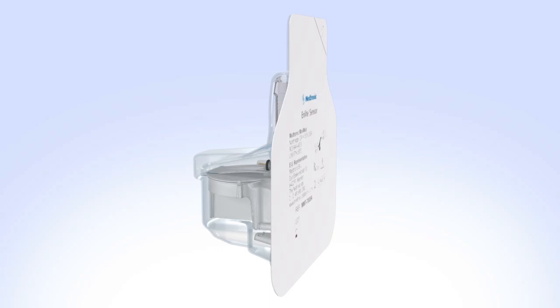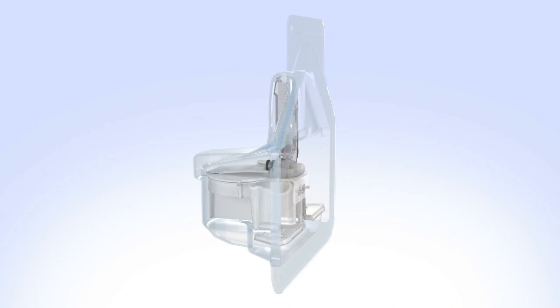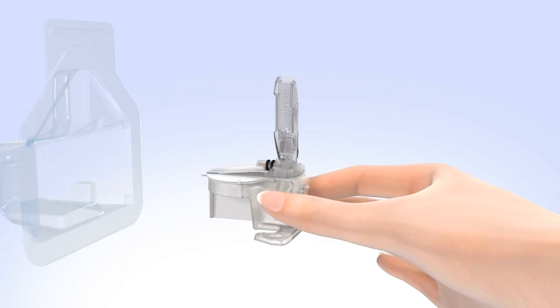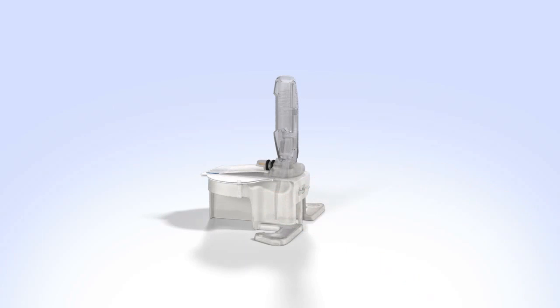Open the N-Lite glucose sensor package. Remove the sensor from the package by holding the plastic pedestal. Do not hold it by the sensor or needle housing as this could damage the sensor. Place the sensor with pedestal on a clean, flat surface, such as a table.